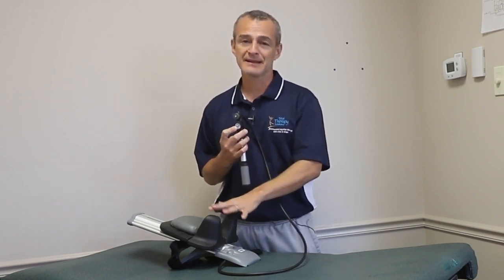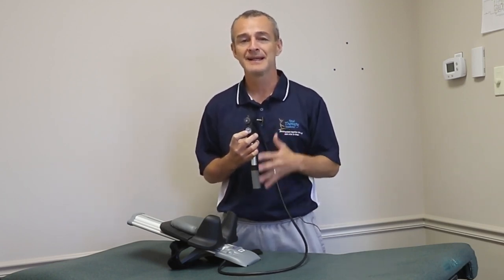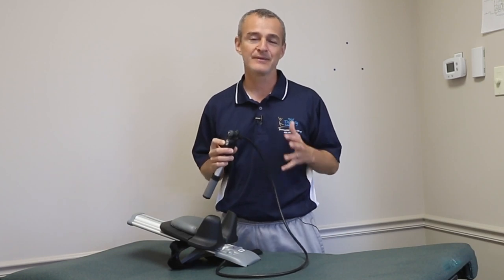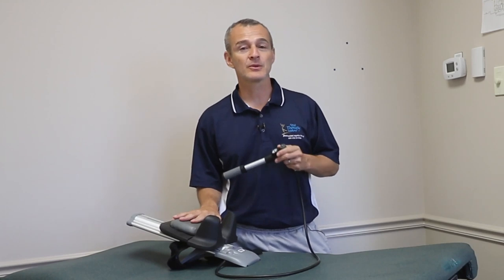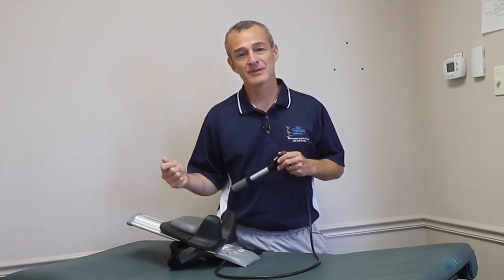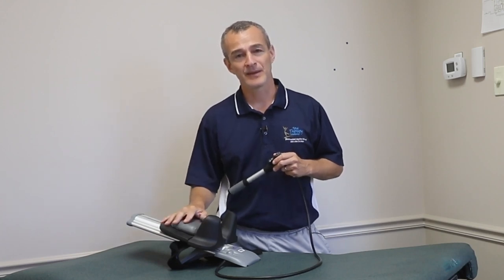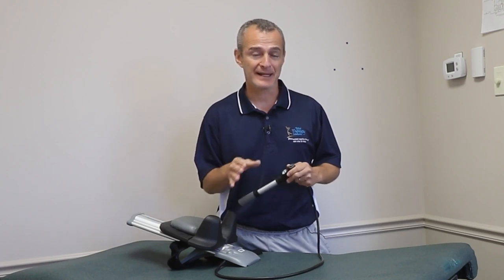Before you use a device like this, you must be assessed by a physician, by a physical therapist, by a chiropractor, by somebody who understands your condition, can test and make sure that everything is safe for you to use. This is just an educational video to give you an idea of what options are out there. Quite often, patients will arrive at my clinic with a referral and an order from their orthopedic surgeon for a cervical traction unit.